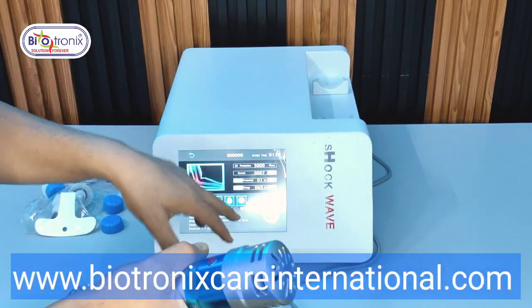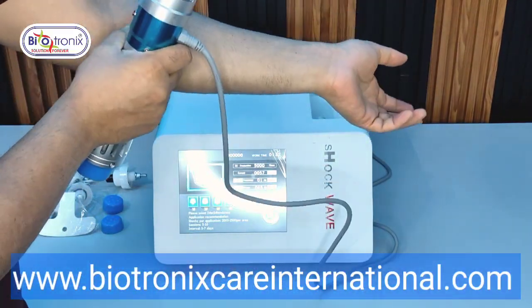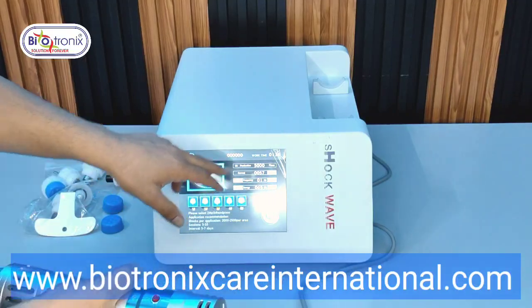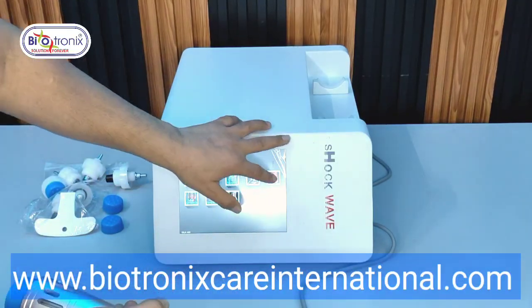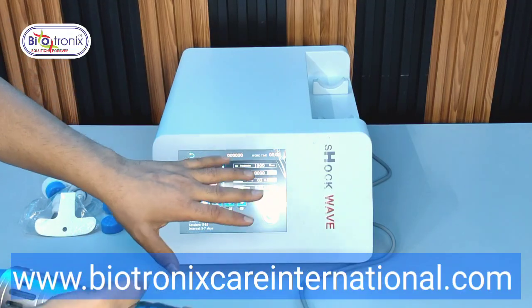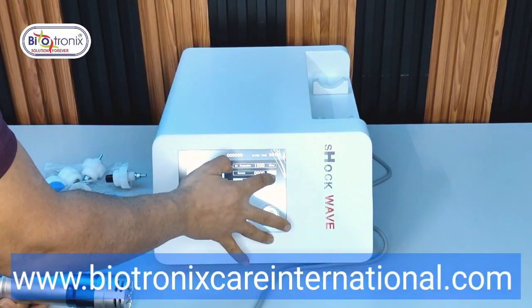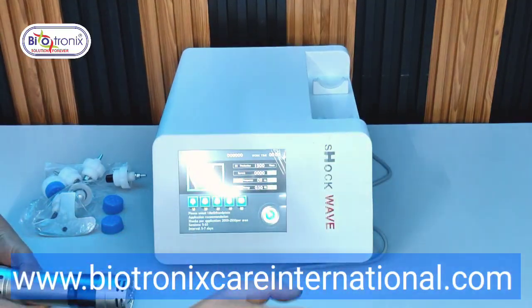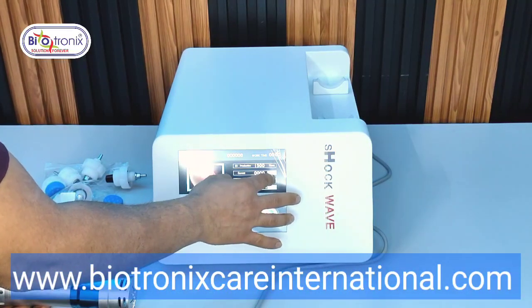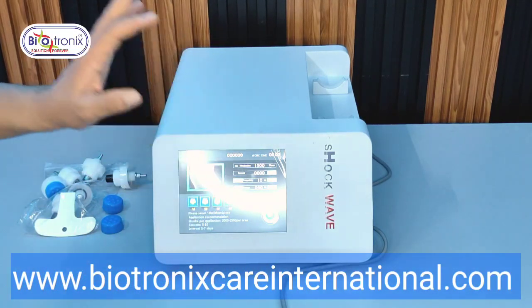If a 200 option is provided and someone has selected it and strikes with it, that joint will get injured rather than healed. So that is why the maximum intensity is there. That is why for the ED section, you can go up to 30 millijoule only, because 30 millijoule for erectile dysfunction is quite enough for that area. And frequency you can go up to 10 Hz.